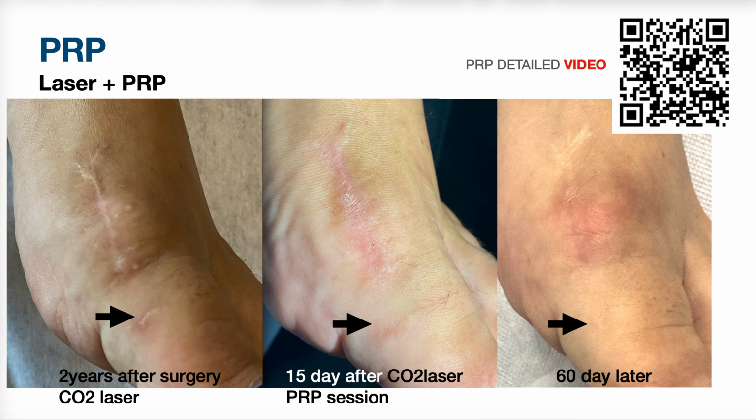This is a clinical case combining laser and PRP. You can see that the detail indicated by the arrows has disappeared. Overall, the scar has become flat and elastic.